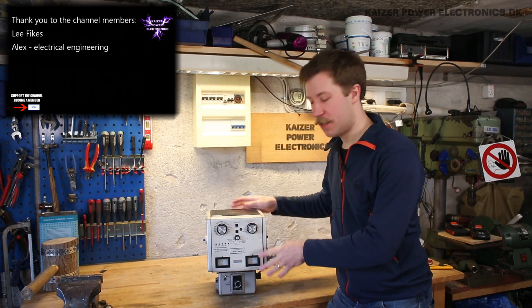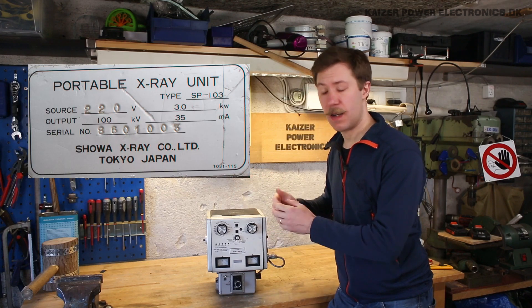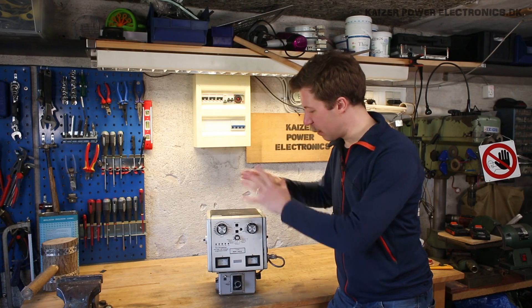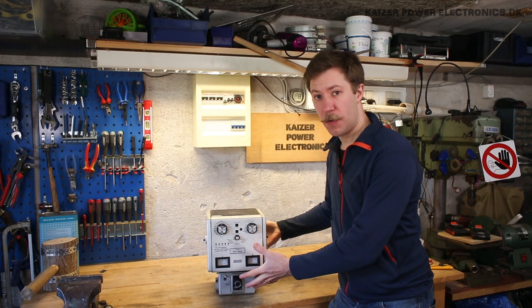It's rather special because it's just one contained unit. This just takes 230V in at 3kW power. It can output 100kV at 35mA. It has everything contained inside — controls, high voltage transformer, x-ray tube, collimator. Everything in this small unit.